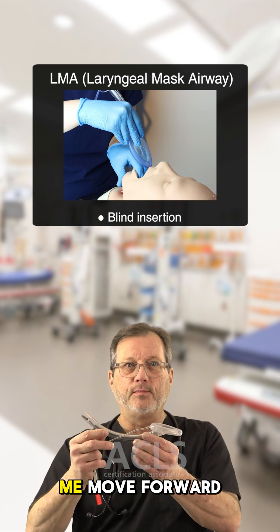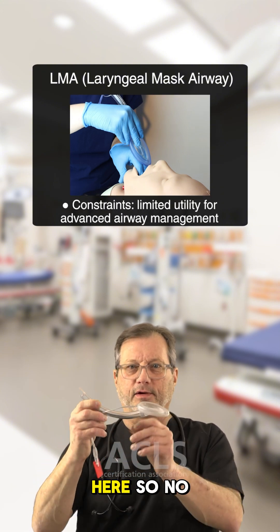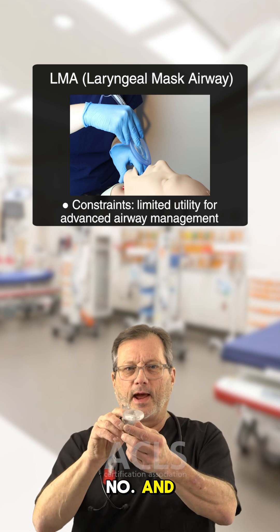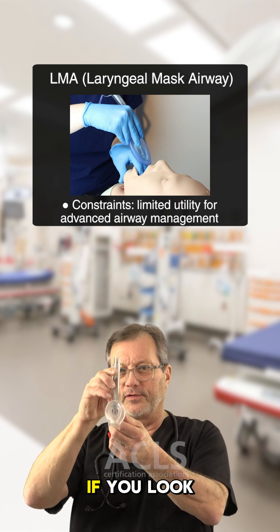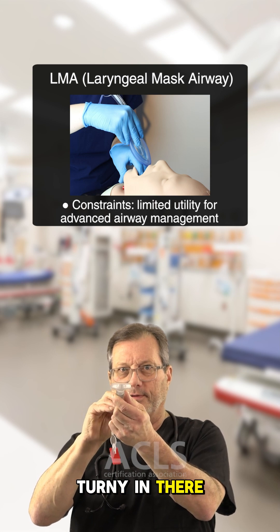Can the LMA help me move forward in my airway management? No — there's nothing coming down, it's blocked. Additionally, during the insertion, if you look at the design, it can get a little twisty-turny in there.